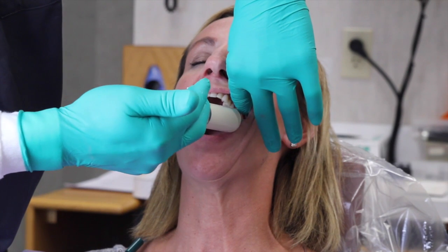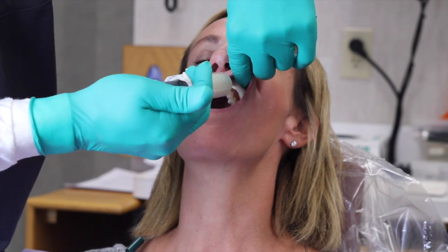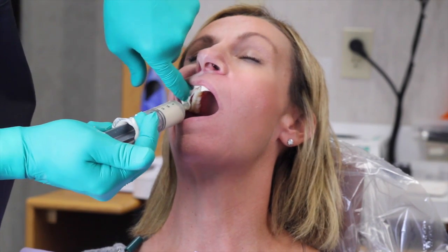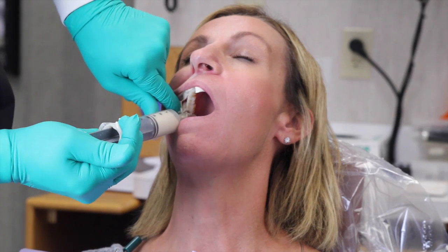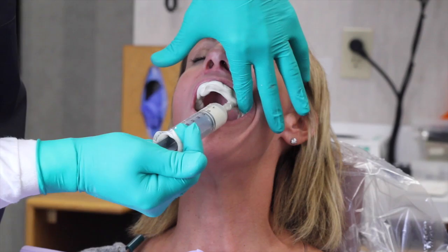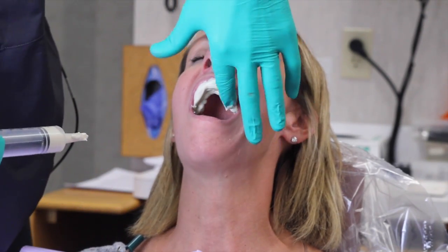And we're going to inject starting in the buccal vestibule, starting in the most posterior area, trying to be continuous here. Trying not to have any interruption of the material so we don't have bubbles or voids in there. We come all the way around there, and then we come up on the occlusal surface. And I'm actually going to try to come around a little bit on the lingual. And now what are we going to do? We're going to wipe, wipe, wipe.